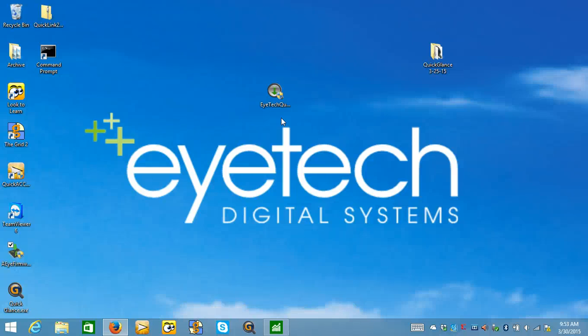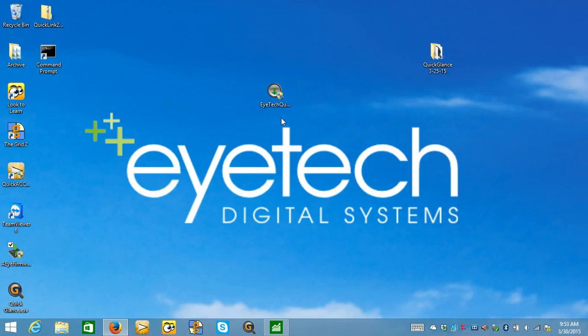Hi, my name is Keith Jackson from iTech. Our new TM5 series eye trackers now seamlessly work with the Grid2.